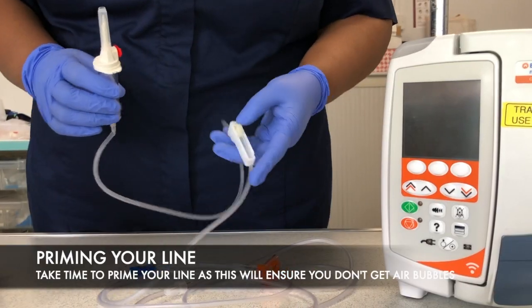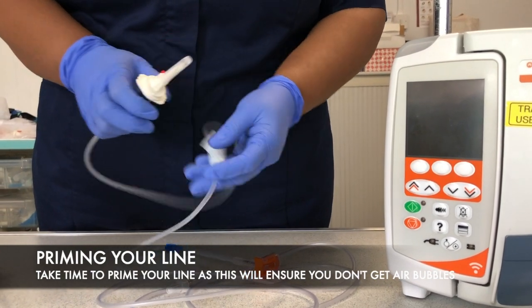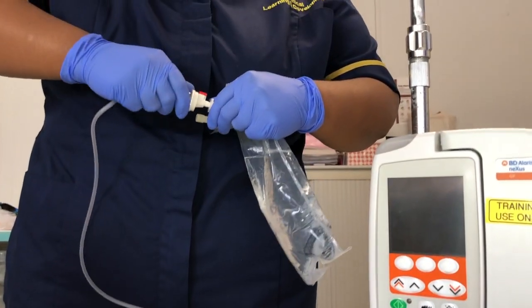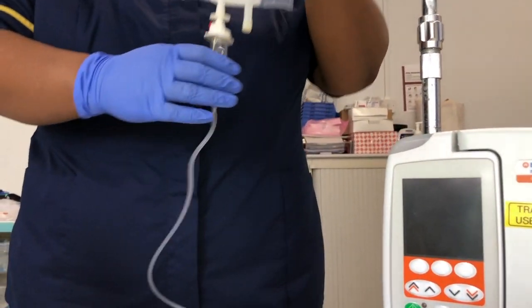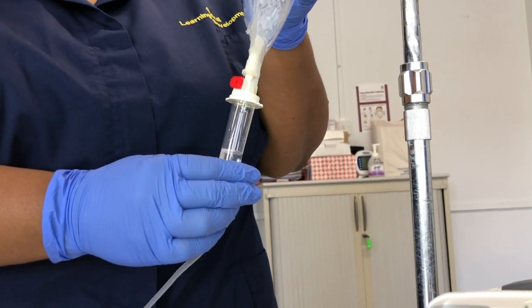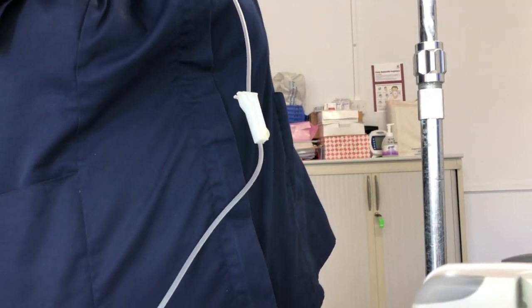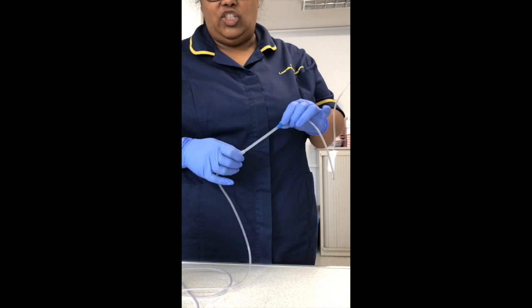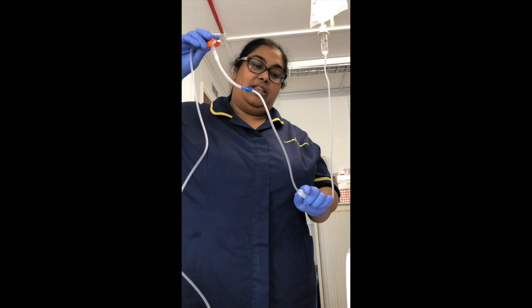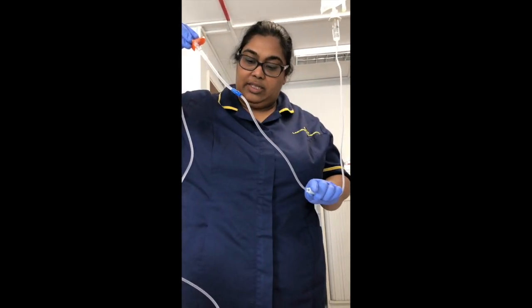When priming your line, all the lines will come with the roller clamp up. Ensure that it is down. Remove the cap, spike your bag, pushing it straight in, and then filling the chamber halfway. This is the silicone part that actually monitors the air in line. So turn that upwards and then slowly open your fluid till all the air is expelled.